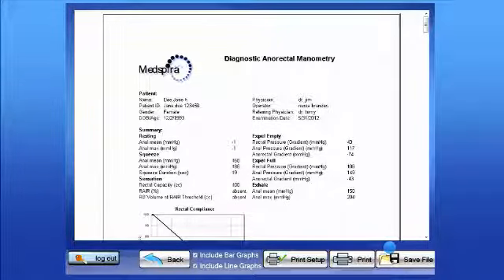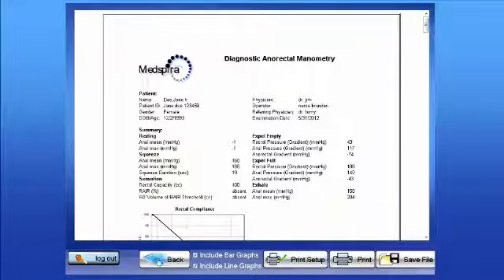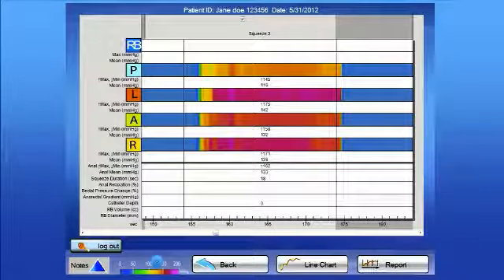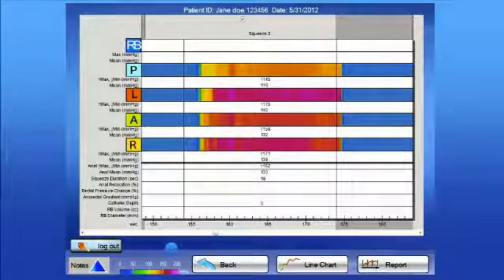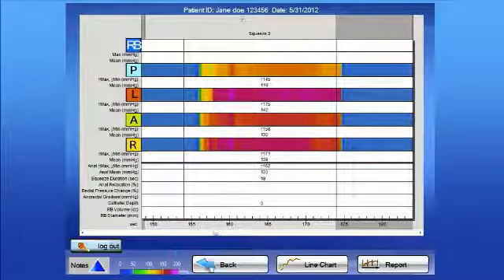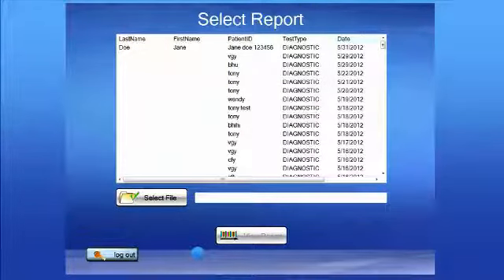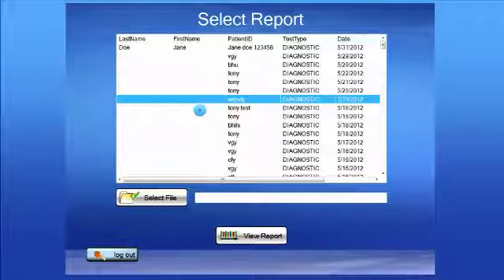At this point, if you are done with that test and you want to go back and see another test, all you have to do is keep going back. And now you will be back into the select report and ready to choose any other report that you would like to review.